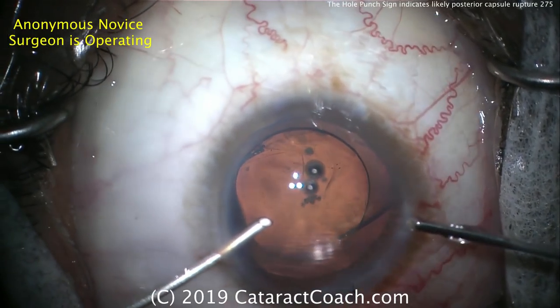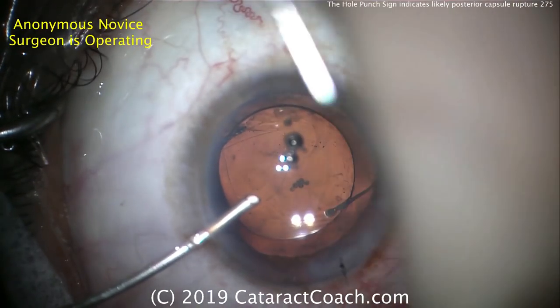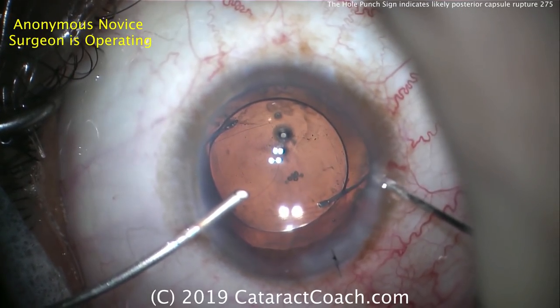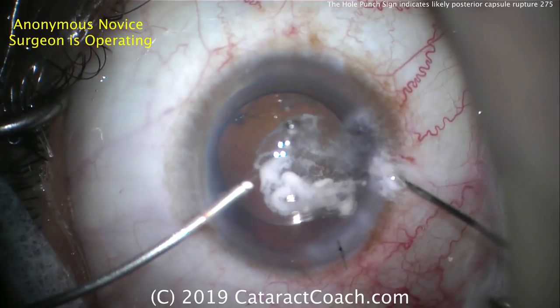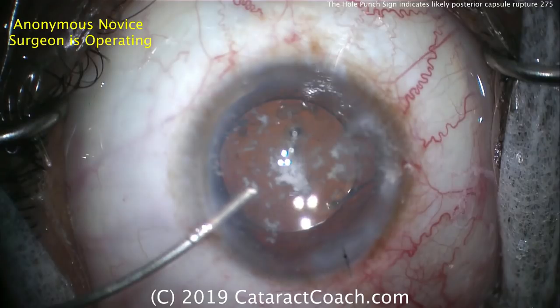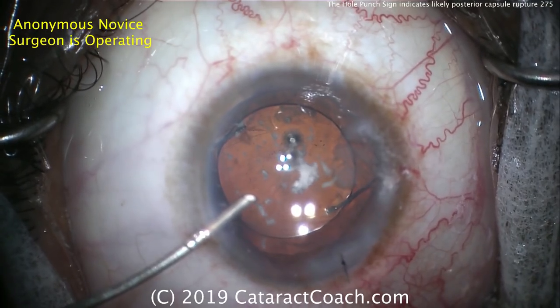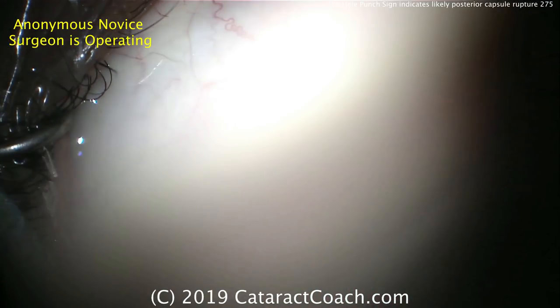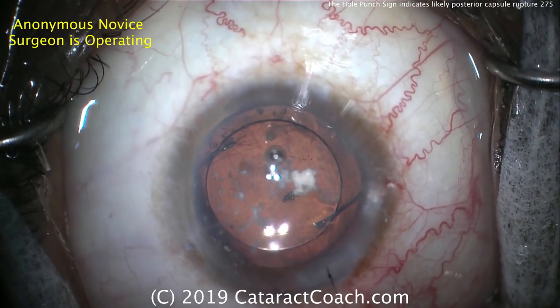Now the main incision is sealed. Removal of viscoelastic and any prolapsed vitreous — I think we're pretty clear of vitreous — so cleaning up and aspirating that out. Here's some triamcinolone going inside the eye — just a small aliquot. The triamcinolone stains the outside of the vitreous, and it'll also have a very nice anti-inflammatory effect. As we swirl the triamcinolone around, if there are big vitreous strands we'll see those. It looks pretty good — maybe a little bit to the right-hand paracentesis, put the cutter in there and aspirate if needed. That looks fantastic.